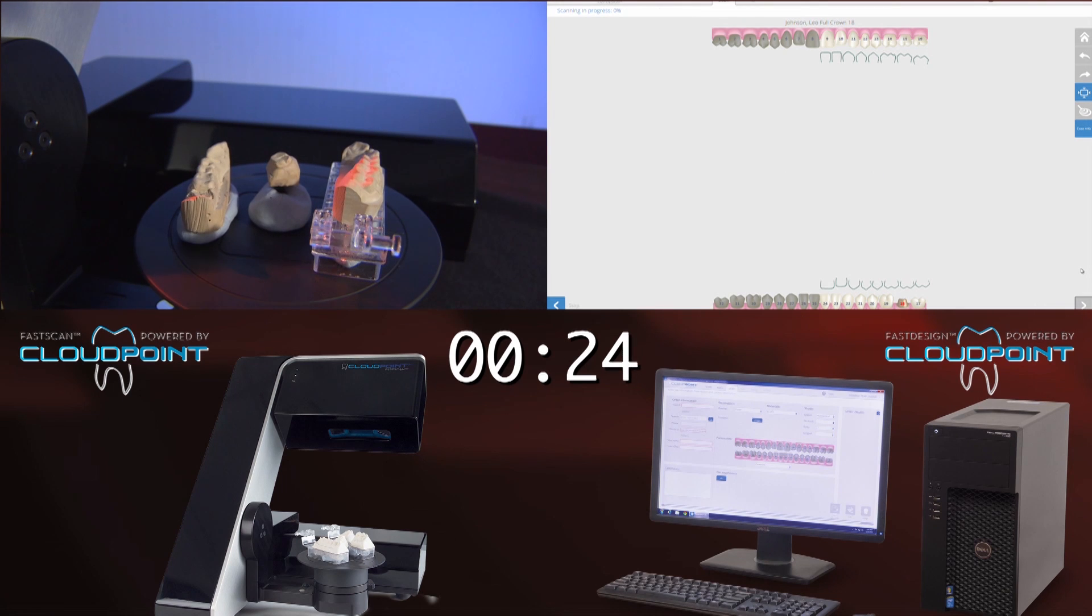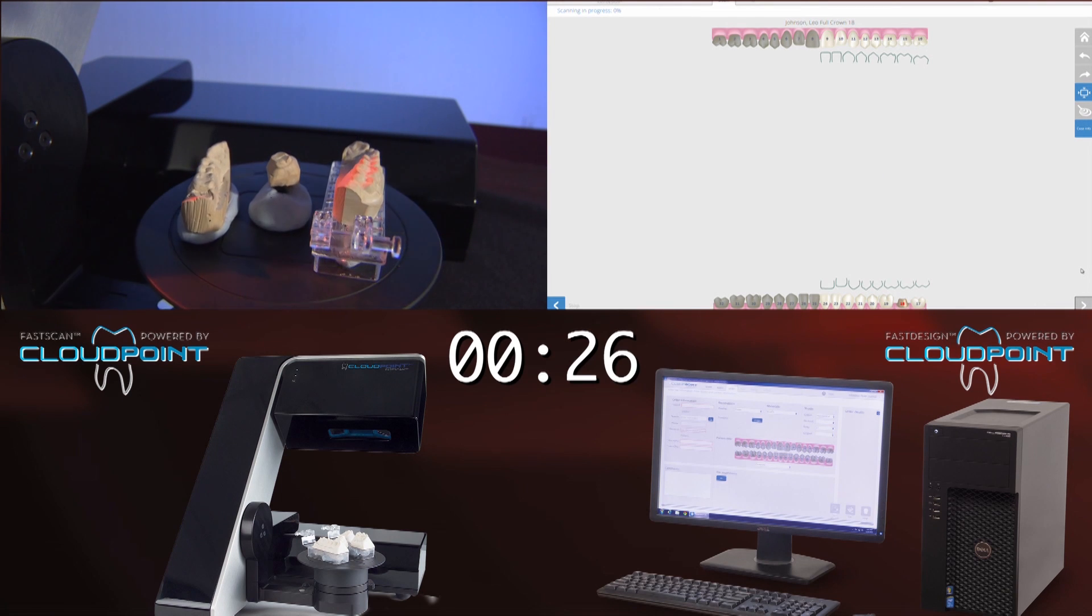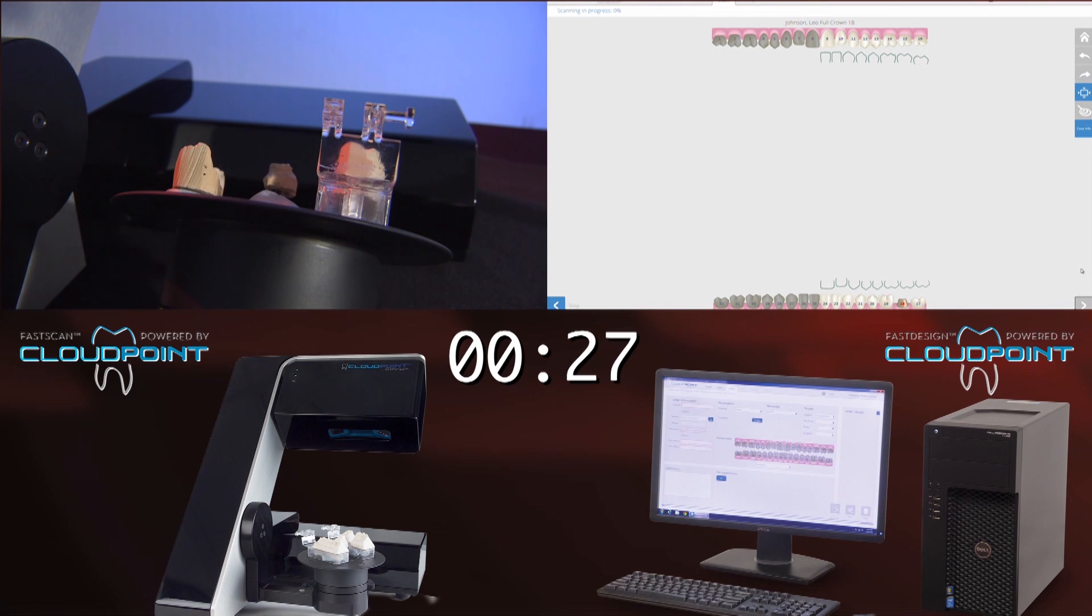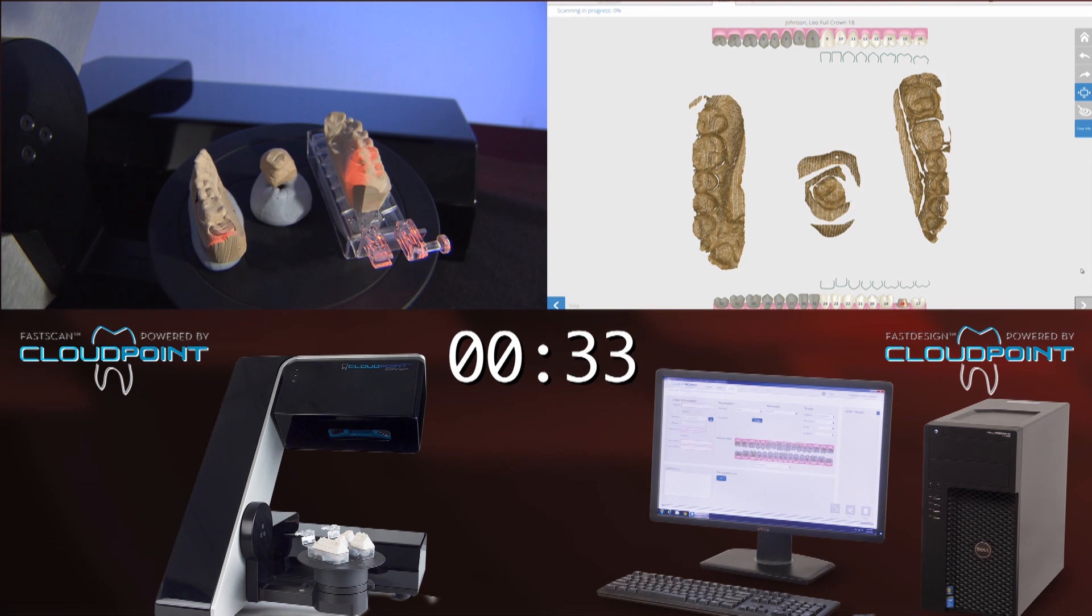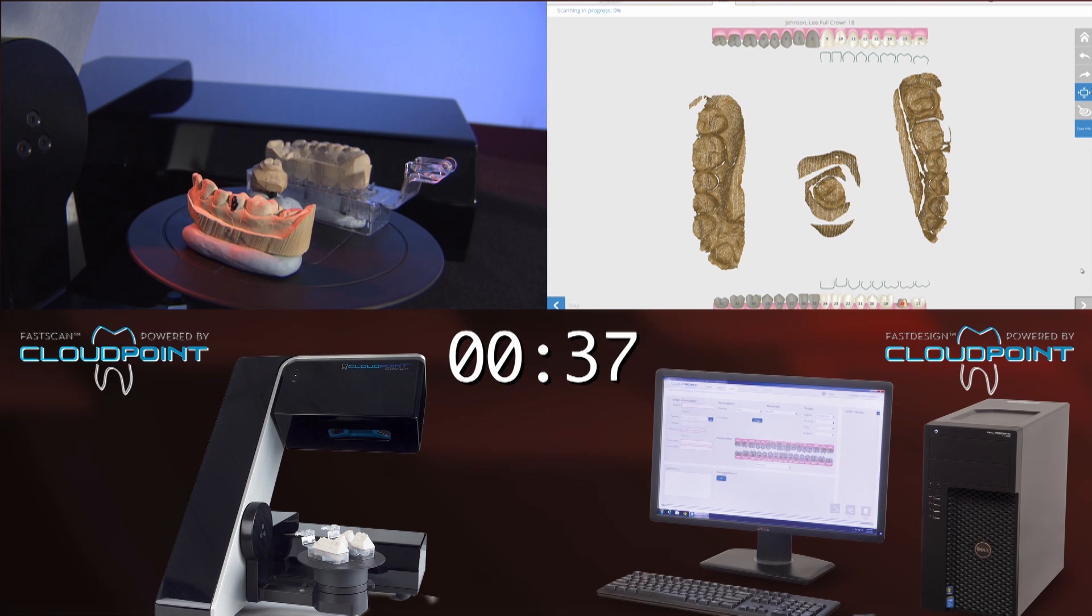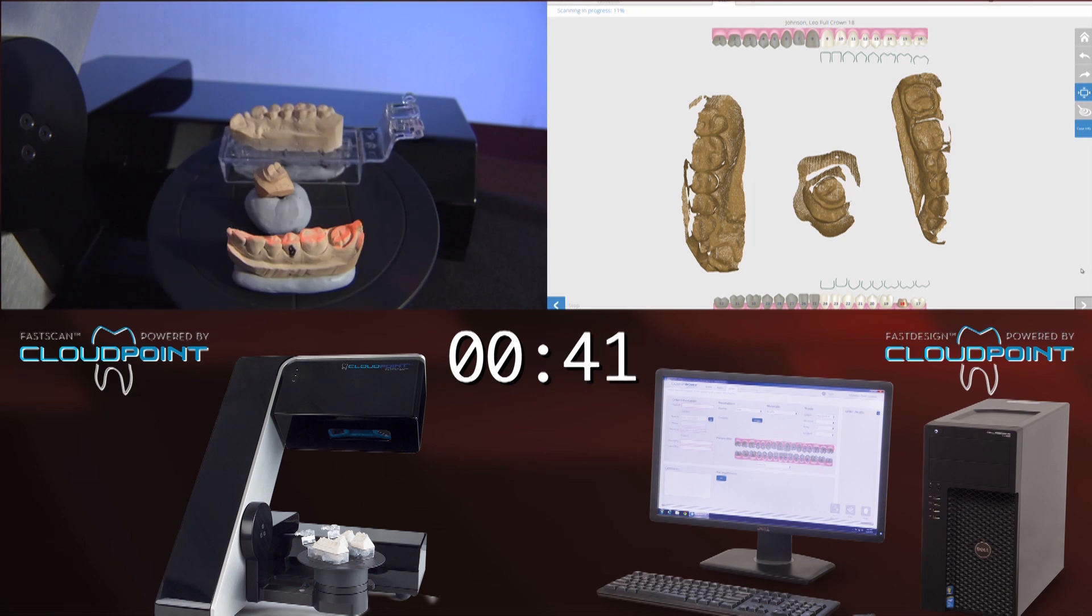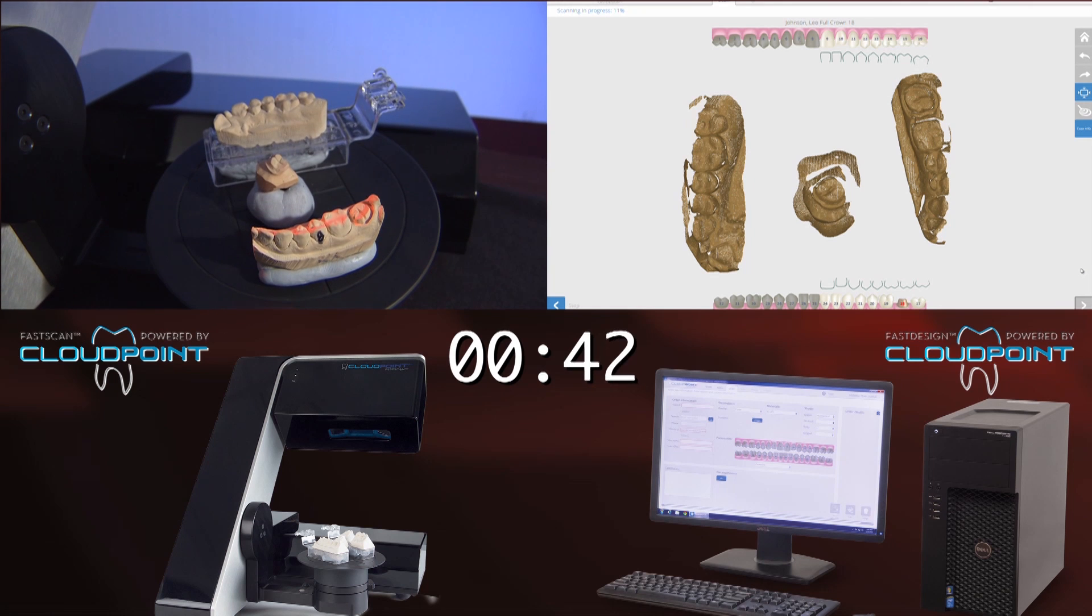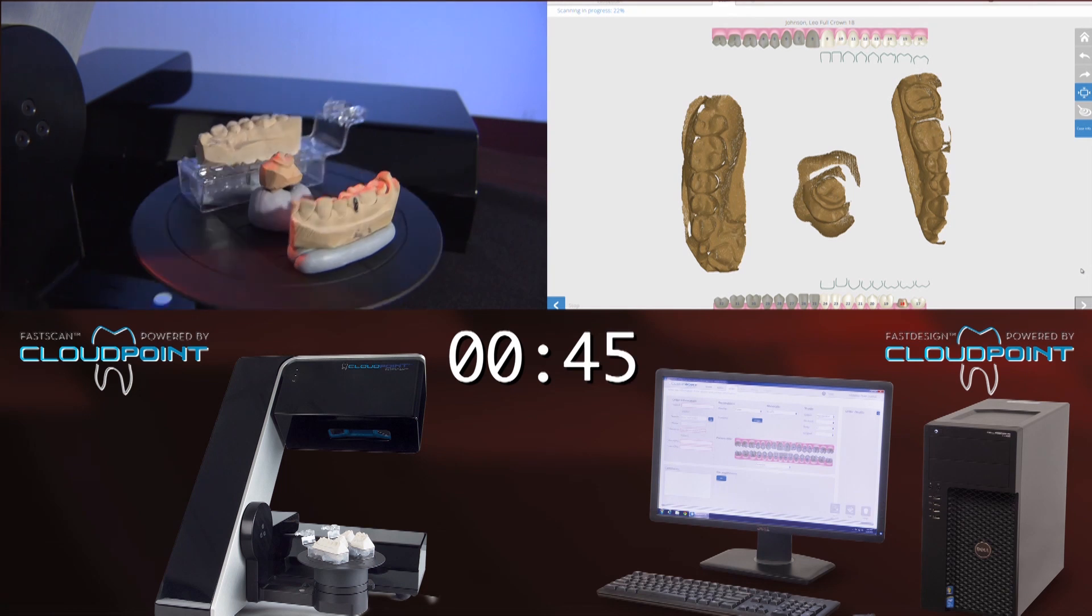Now it's going to scan all at the same time. You can see the die with the margins trimmed on the very middle of the plate as it tips it to its seven predetermined positions. Then you can see the solid model with the prep on it to the left, and then you can see the opposing model over there. And then over on the right, you can see the acquisition screen as it actually gets all this information and starts to put it together.